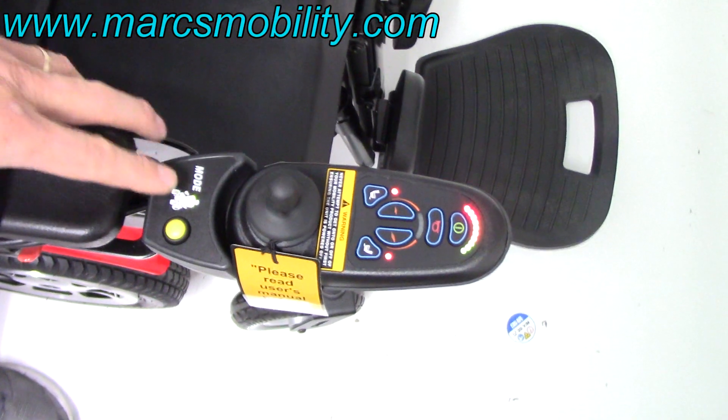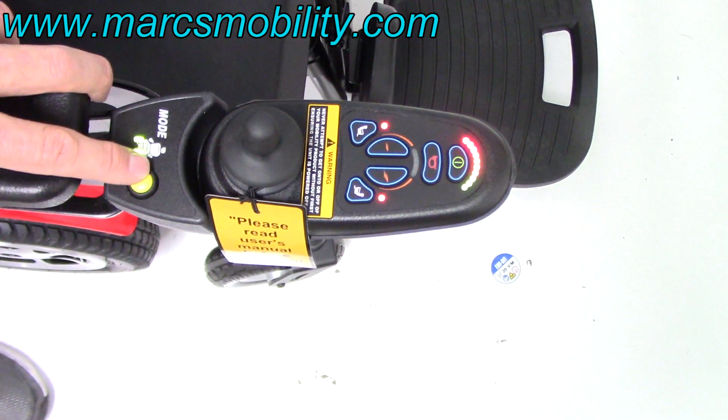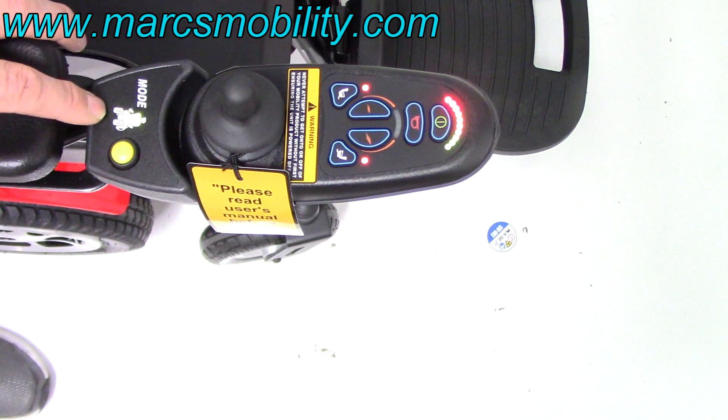You have a button here for the seat. Once you turn it on, you go to the bottom which says 'mode.' If you hit that button, you can see the light — now it's on the legs, now it's on the tilt. Hit it again and that would be just the tilt with two lights.